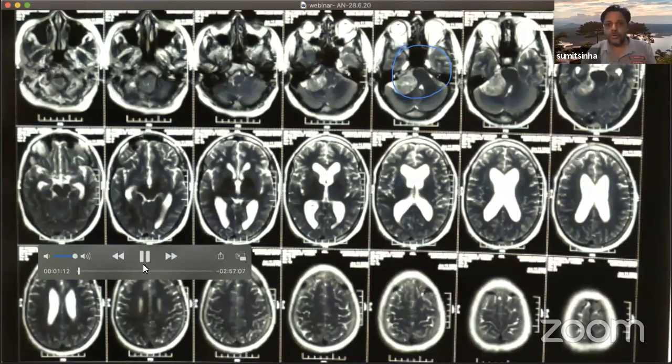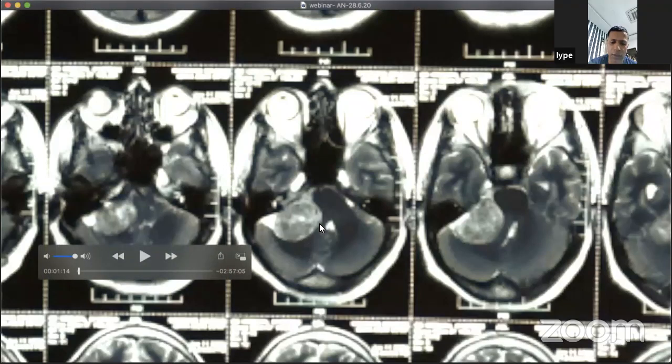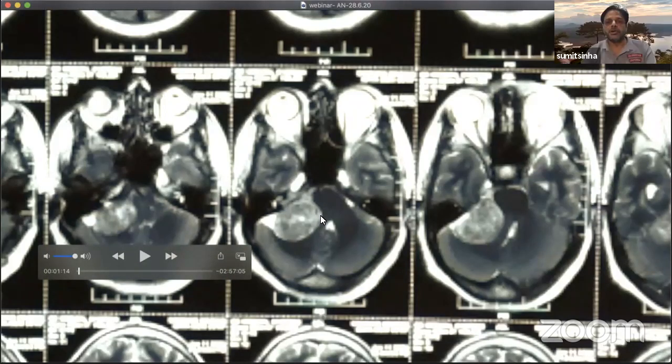So this is the thing which I was talking about. Look at the CSF cleft. When you see such a cystic space, a white, hyperintense area, this is good news for an operating neurosurgeon. I mean, you can get into the cleft and dissect some or most of the tumor from the cerebellum and the brainstem.